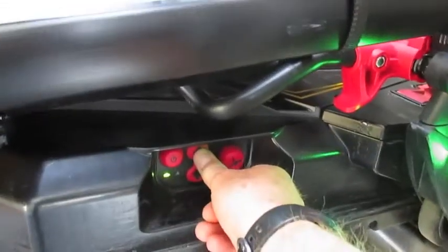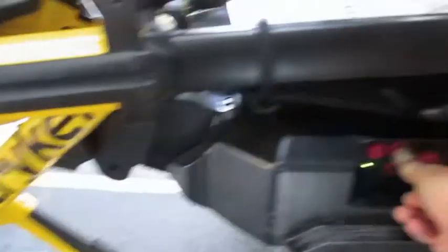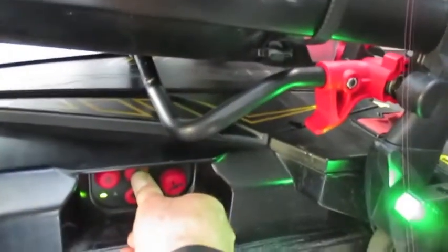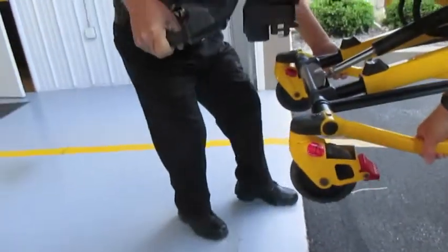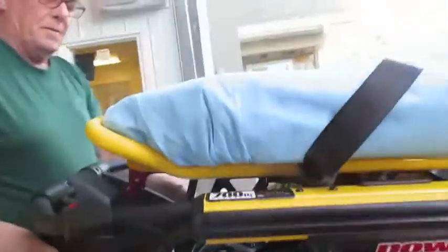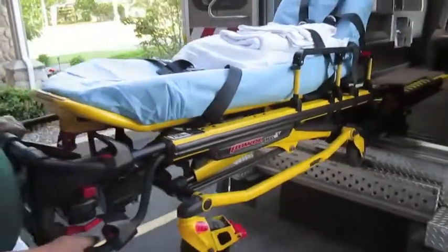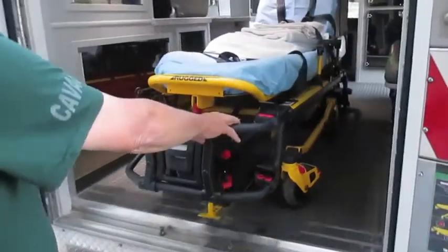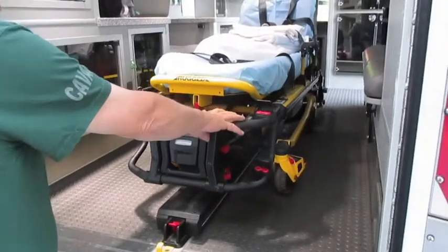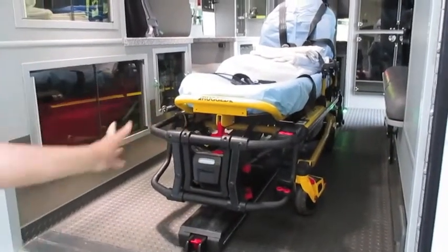We're going to lift up first, which lifts up the whole thing. Now we're going to use the release again and then lift manually. Release — and hopefully it's going to stay up — and away it goes.